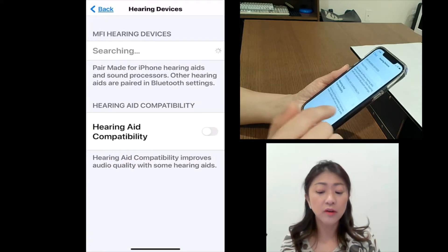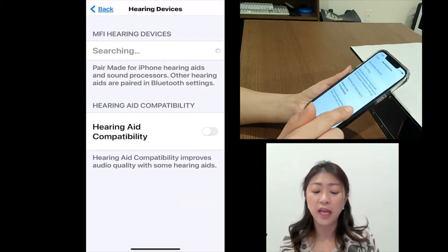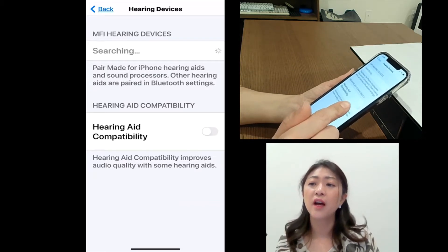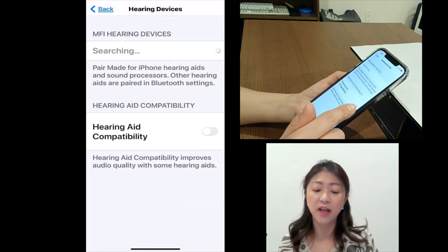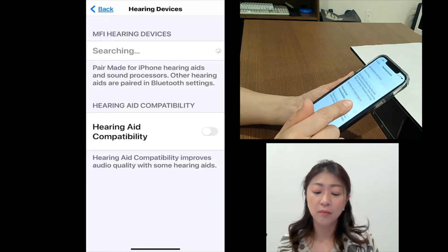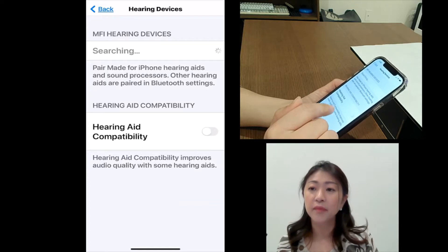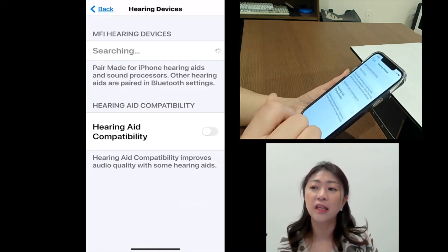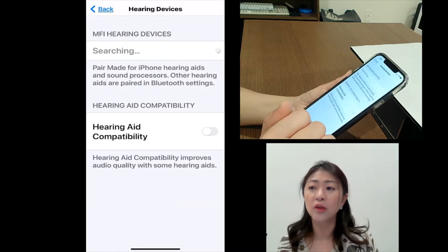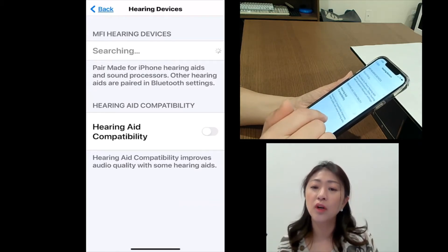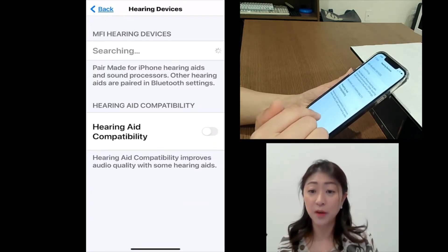If I tap and go into Hearing Devices, this is where you can sync the iPhone compatible hearing aid. If you have MFI, which stands for Made for iPhone — the MFI compatible hearing aid — then you will see it under the list of MFI hearing devices. When you select it, you can connect it directly to your iPhone, so the sound you hear on your iPhone can be transmitted directly to the MFI hearing aid. You can ask your audiologist about iPhone compatible hearing aids.